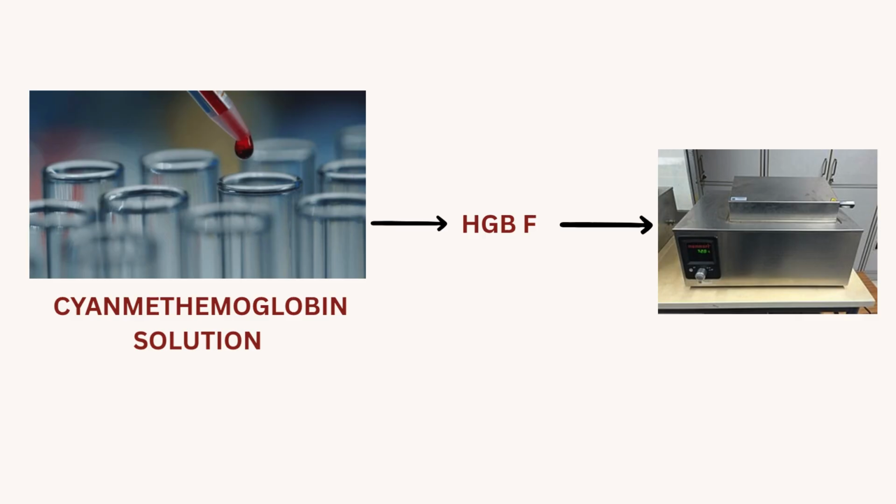Afterwards, add 0.2 ml of 1.2 normal sodium hydroxide to the first test tube and rapidly mix. Allow to incubate for exactly 2 minutes. At exactly 2 minutes, add 2 ml of saturated ammonium sulfate directly into the solution and quickly mix the tube to stop the reaction. Allow the tube to stand at room temperature for 5 to 10 minutes.